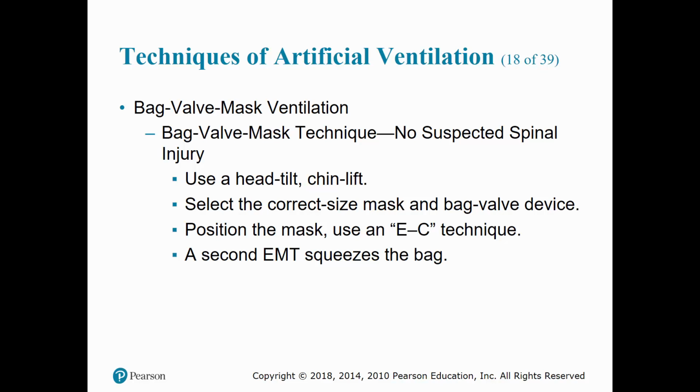Have another EMT connect the bag valve to the mask if it is not already attached. Begin ventilations as soon as possible. The other EMT or qualified person will squeeze the bag with 2 hands and deliver the ventilation steadily over 1 second while watching for adequate chest rise. Make sure that you're delivering your breaths accordingly depending on the age of patient you have.